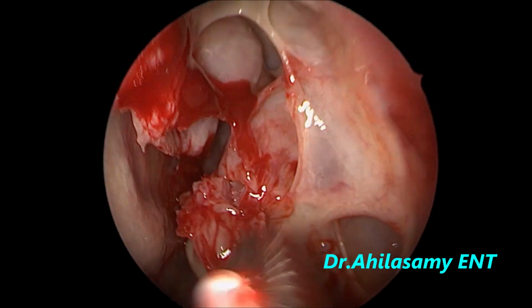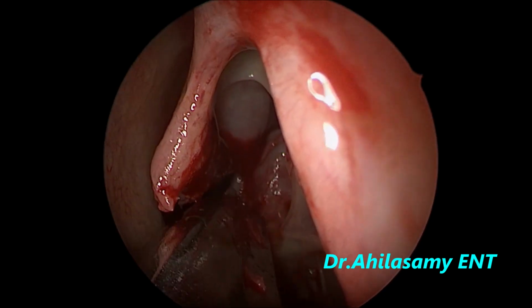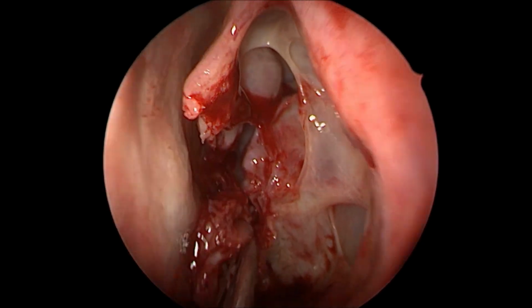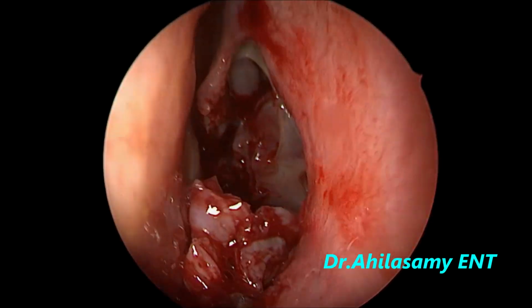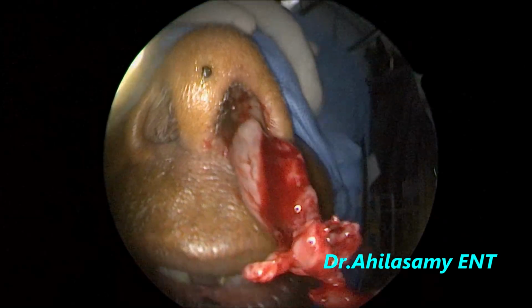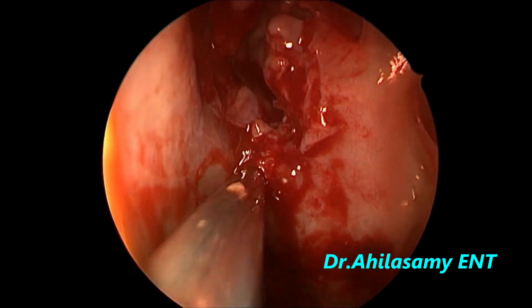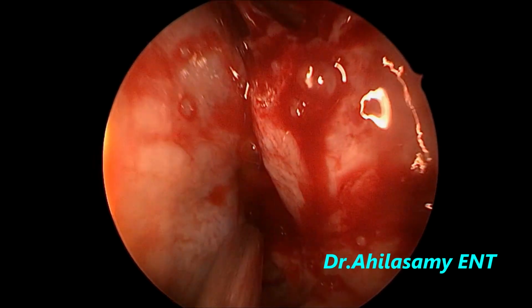I hardly used a shaver system in this case. There's a posterior attachment of the middle turbinate. Appreciate the field quality, hardly any bleeding. Now, the remaining mass which had been attached to the middle turbinate is resected with a clear margin of around 5 to 6 millimeters. So you can't expect any recurrence from this mass.